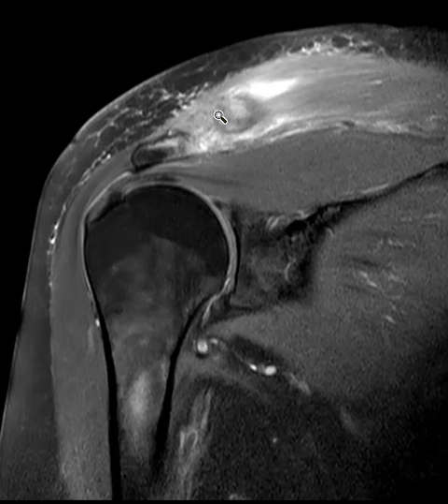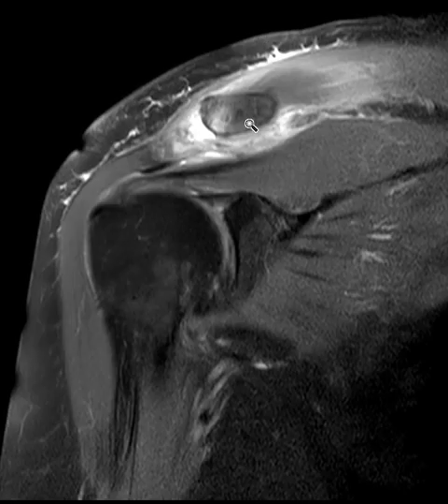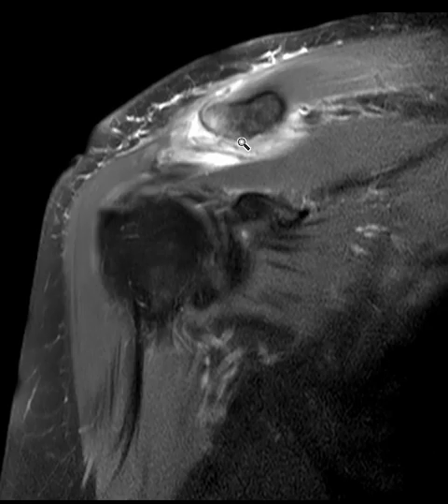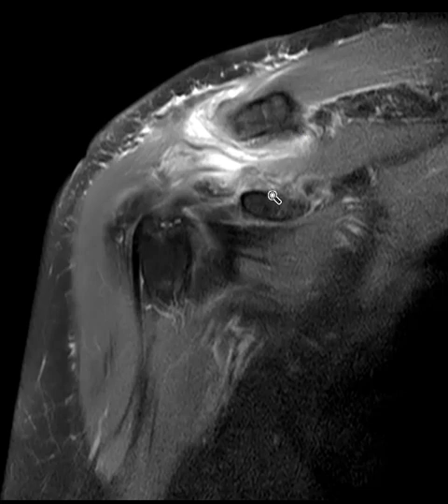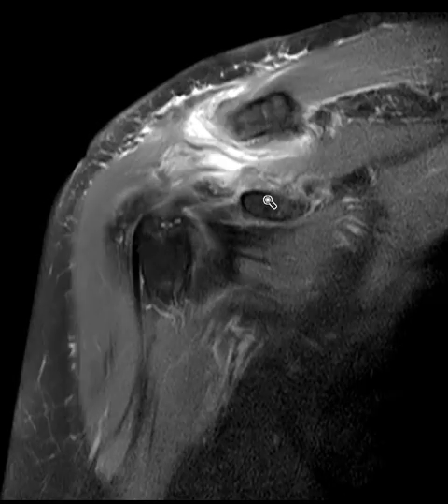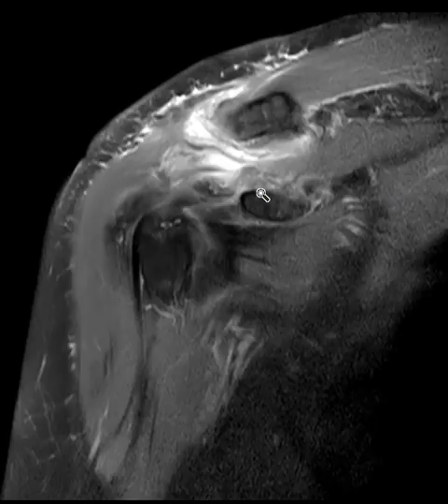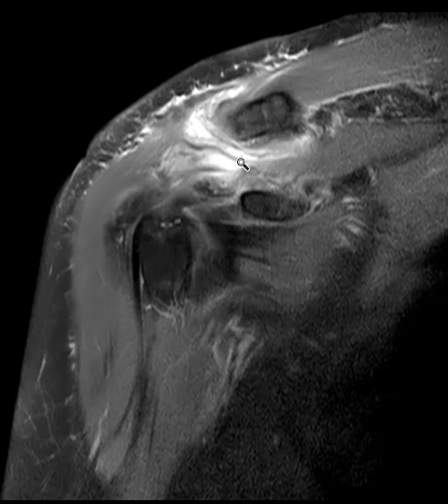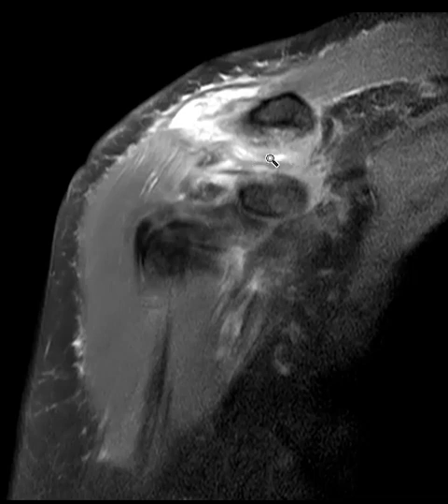The clavicle is in an abnormal elevated position instead of being close here. There's another ligament complex more medial — along the undersurface of the clavicle there's a little dark band, which is part of the coraco-clavicular ligament complex. This ligament has broad components that come down and hold the clavicle low near the coracoid process. This coraco-clavicular ligament complex is completely torn — instead of seeing a nice dark band, we see brightness, fluid, and edema.